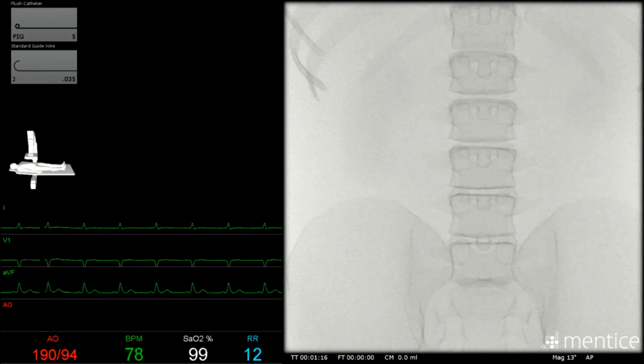As you can see, we have fluoroscopy of the patient, a graphic of the C-arm and operating table position, and the patient's vitals. We can see our selected devices up in the top left. They are greyed out at the moment, as we have not yet inserted them into the machine. These will illuminate once the simulator recognises tools being inserted, as you will see now.